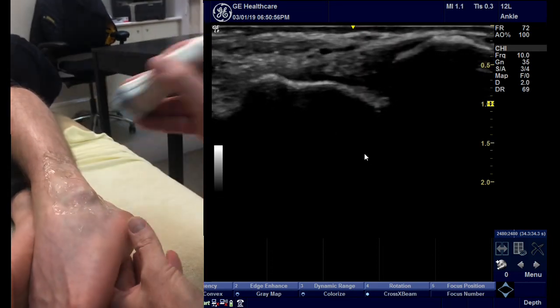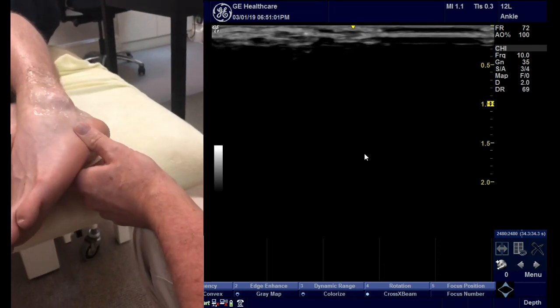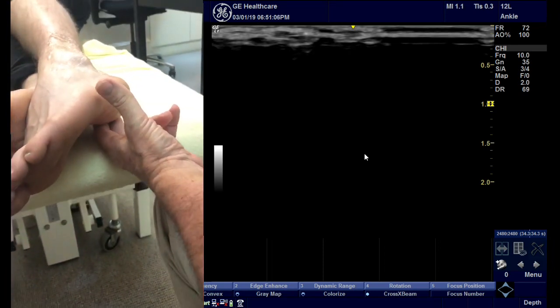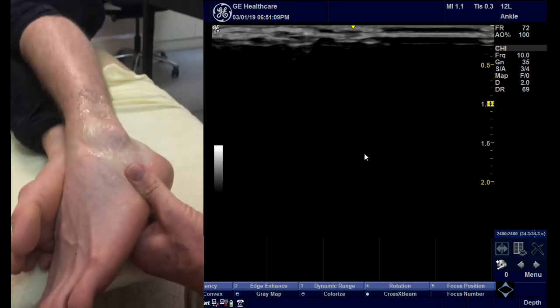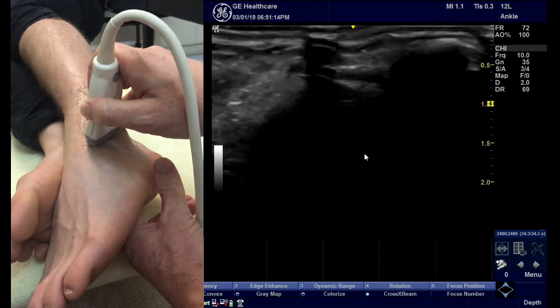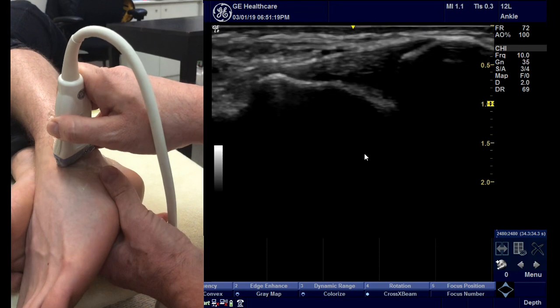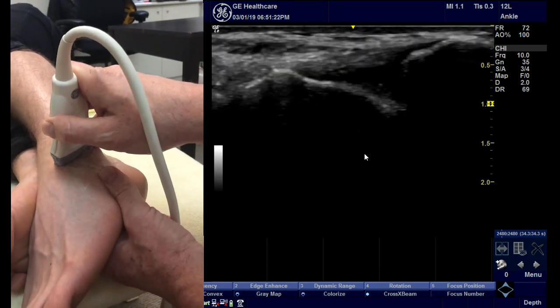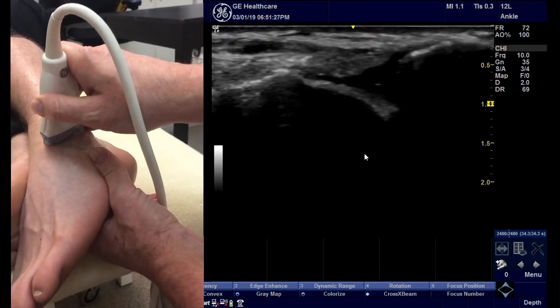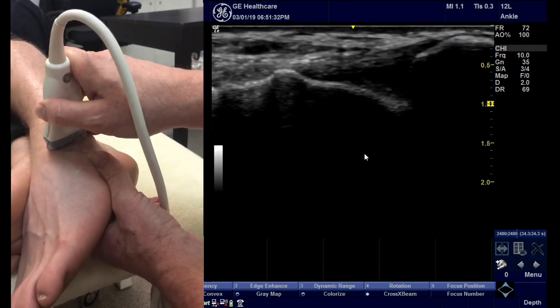So if you look at the video, I've got my thumb on the cuboid and I've got my two fingers on the medial side of the calcaneus, and I'm just going to do a twisting action there. And that's enough to test the ligament. So there's the ligament again, and when I put that torque on, that puts a stretch, moves the talus away from the calcaneus, and the ligament here is nice and secure.